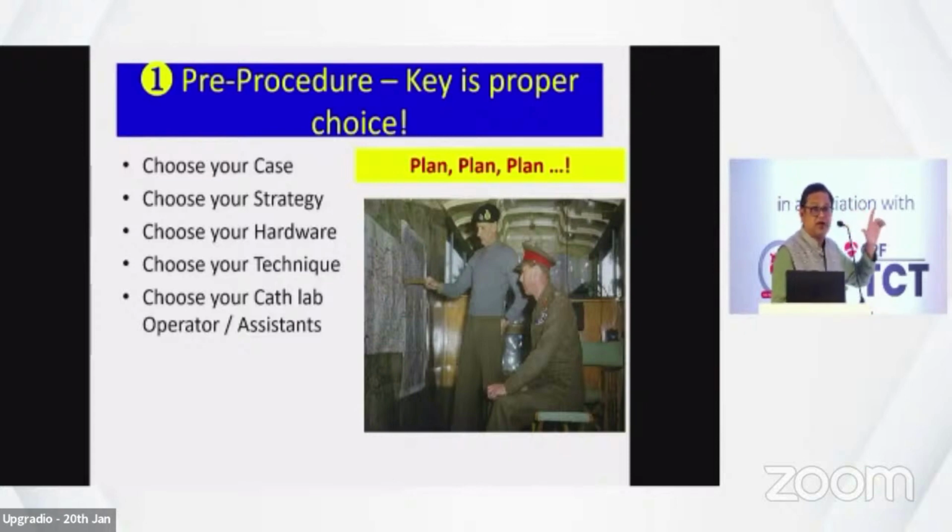Then based on your strategy, properly choose the hardware, properly choose your technique, and also choose your operators or assistants, because you know that this is a complicated case. Dr. Anil was referring again and again to his assistants. So mostly he was choosing his assistants in those complex cases because he knew that things could go wrong and therefore have the right people in place.